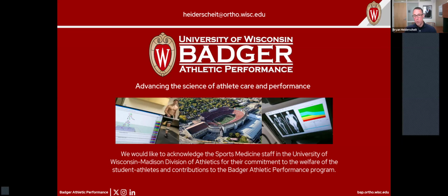The bone tracking is done post-processing wise, very quickly. It doesn't take much time, and we're currently working to see if this can actually become more point of care, brought into the unit to be assessed very quickly at the time the image is captured and just become part of the image capture processing, all in real time.